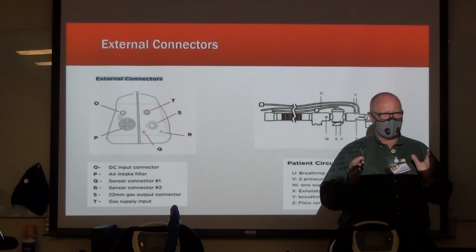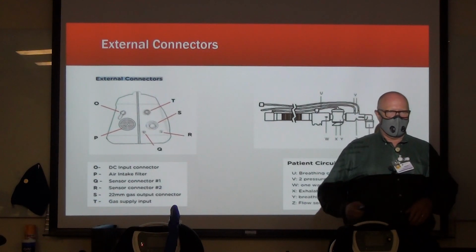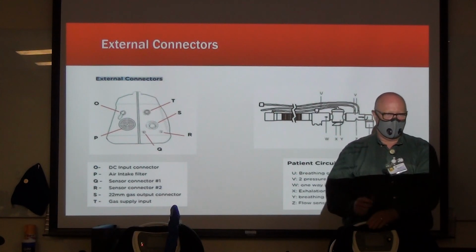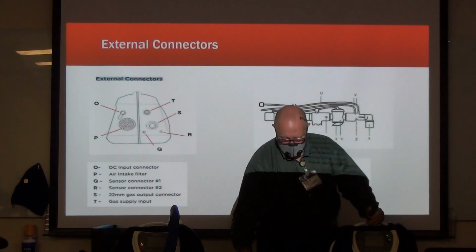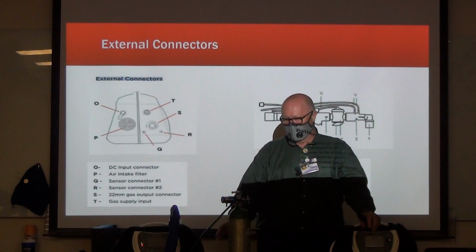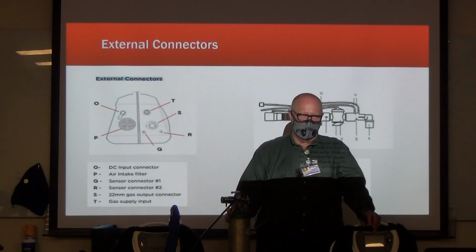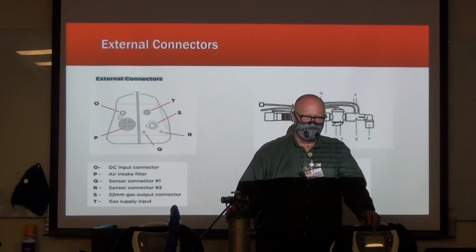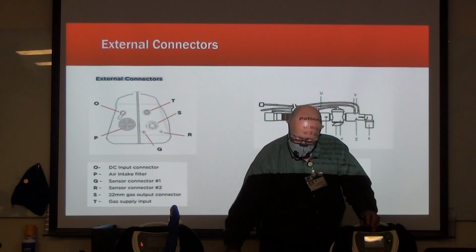And then once you get that, if you feel your patient is stable on your vent, then you're able to move them over. And right before you walk out the door, take them off the wall, put them on your tank, and then go. I can burn through this tank here on 100% FiO2, doing what we do in the classroom, in probably about 15 minutes. Or I can make it last over an hour at 60% doing the same thing. So just realize you do have some time limitations on that.